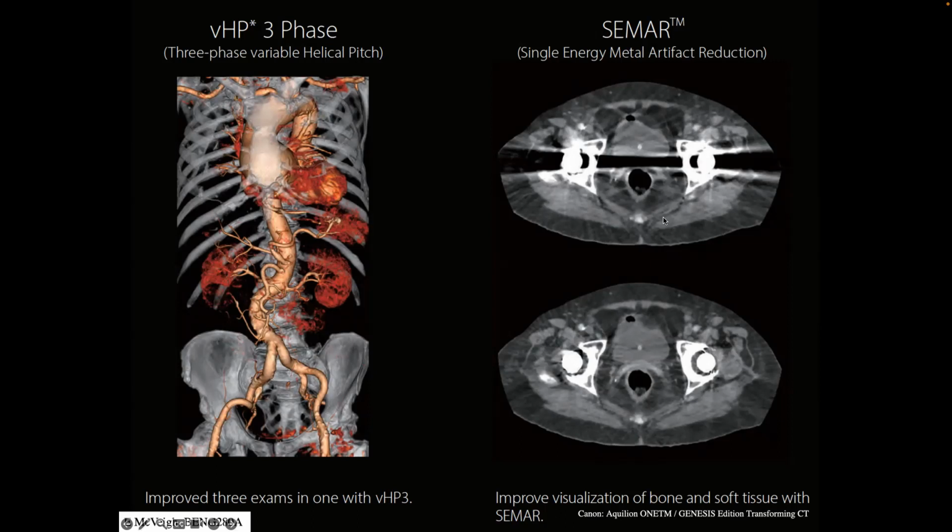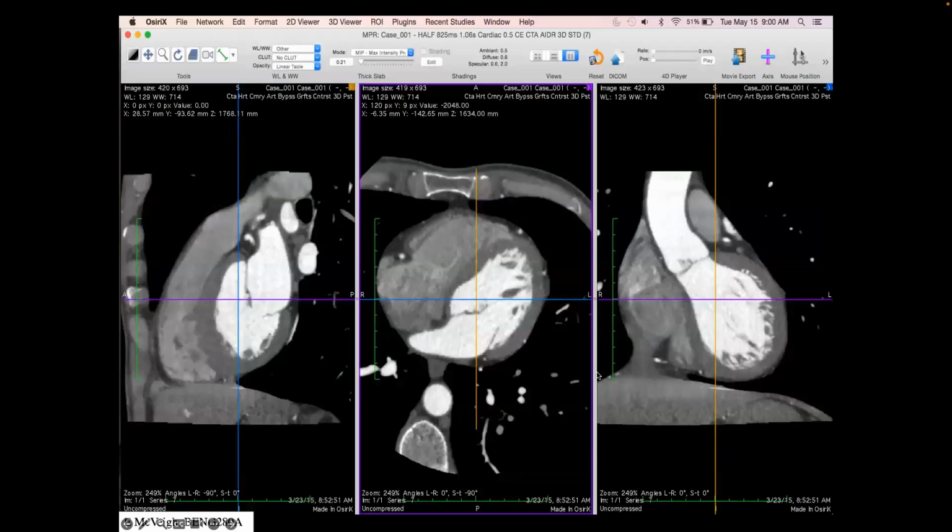In modern CT scanners, they are compensating now for high X-ray attenuators like hip implants, cardiac pacemakers, things like that that absorb X-rays very highly. And so they cast a really hard shadow. And so if you just do standard reconstruction, you can see that there's this huge artifact from missing signal between the two hips. This person has 2 artificial hips, right? But when you take into account that those hips are there and you do some smart analysis, you can get rid of that artifact, or at least reduce it a lot.